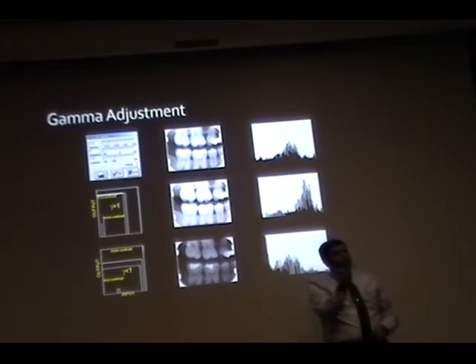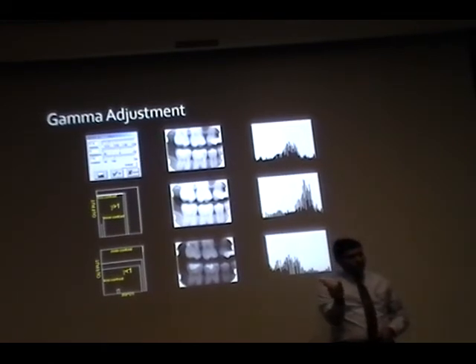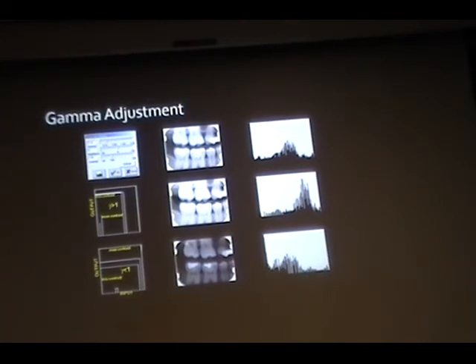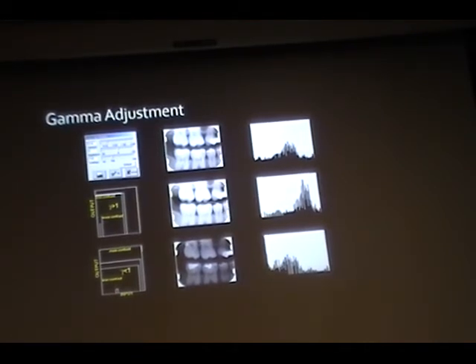This is called post-processing. But how is this different than light adjustments? So, contrast and brightness. Remember, brightness is like you're making it more white completely, whereas contrast, you're giving little shades of gray, multiple of those. Gamma does everything. So ultimately, the gamma is what is required.